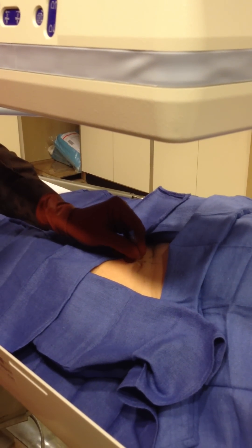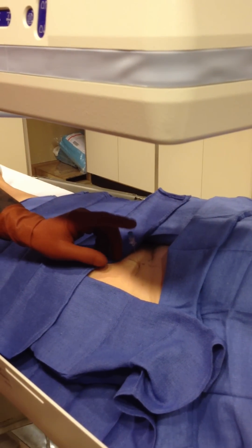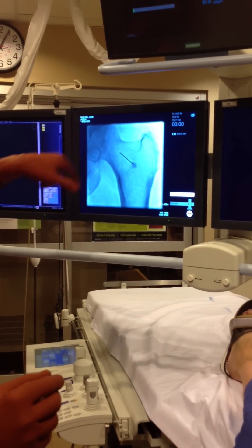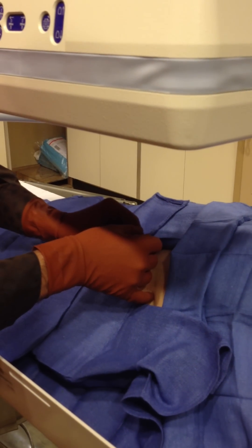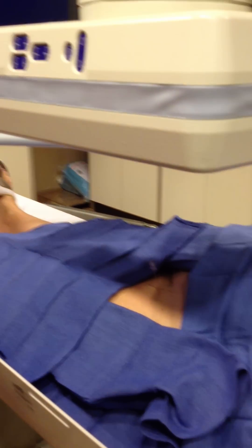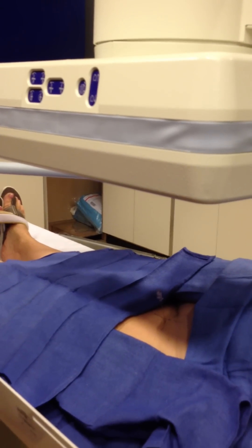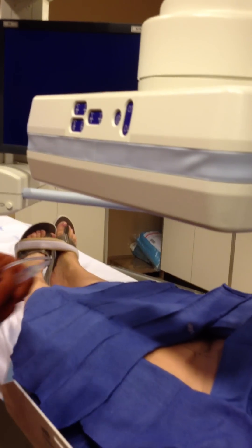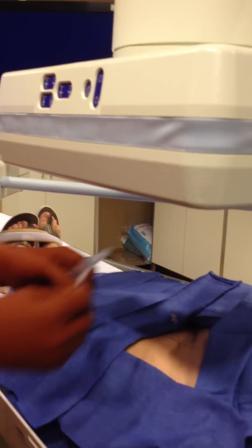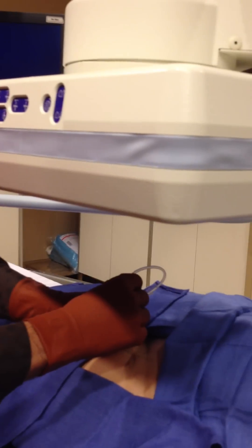Just go down until I hit bone. So now I'm on bone. Check it here — that should be a good spot. But just because it looks like it's in a good spot doesn't mean you're in the joint — it depends on the joint capsule. Sometimes the joint capsule can be very tight, as in adhesive capsulitis, and it's like putting the needle between pages in a book.